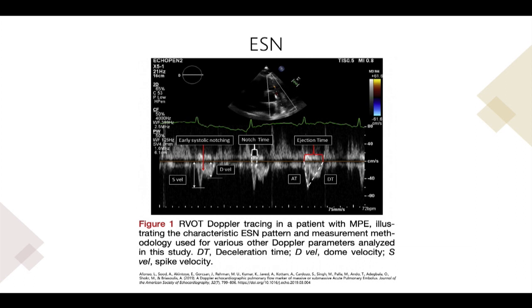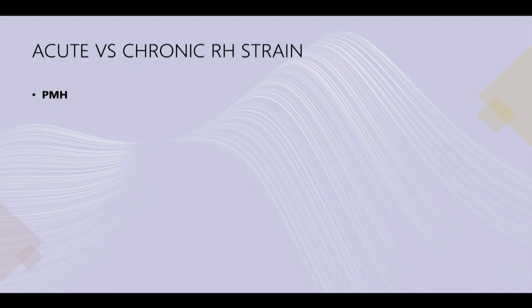When you combine pretty much all the signs that I just talked to you about, if you're doing all these signs on your patient, you could almost approach a specificity for PE of like 100% and almost rule out PE if all these signs are negative pretty much. And when I say PE, I'm usually referring to massive versus submassive PE. Subsegmental PE will have different sensitivities and specificities.